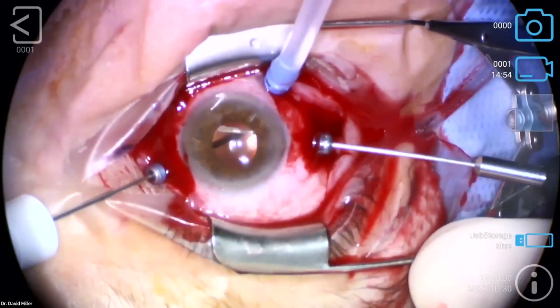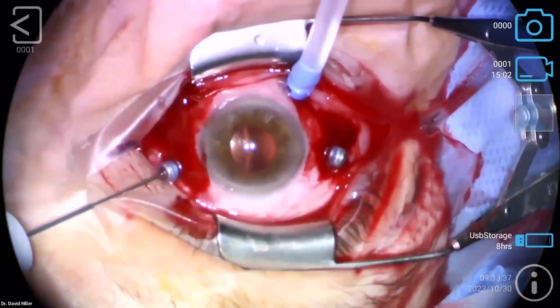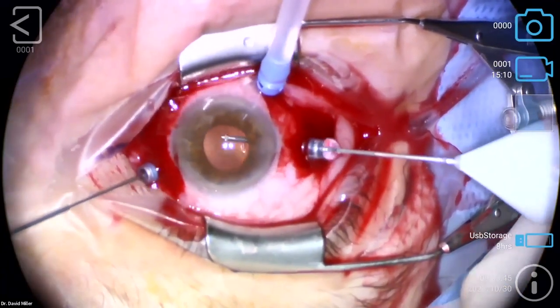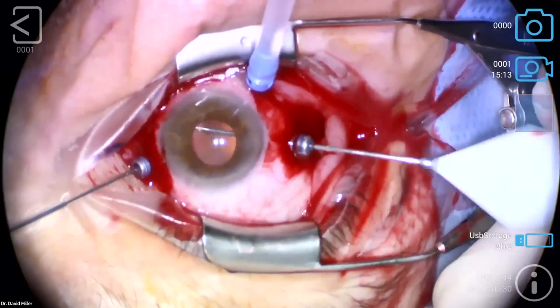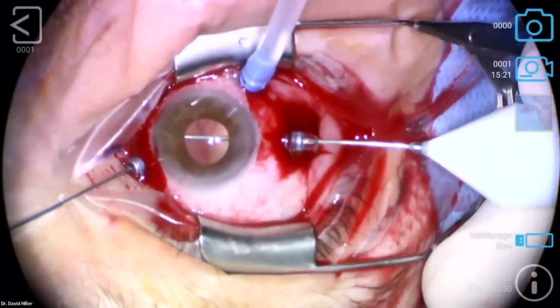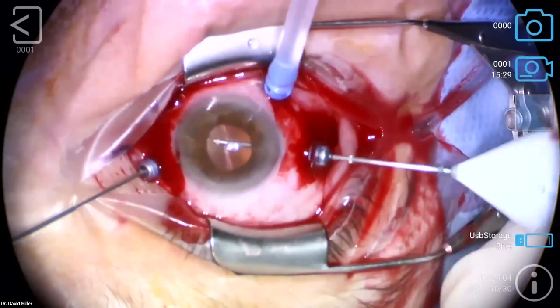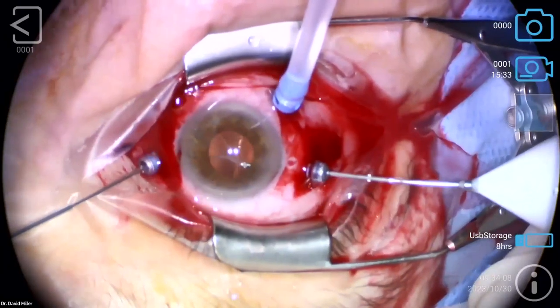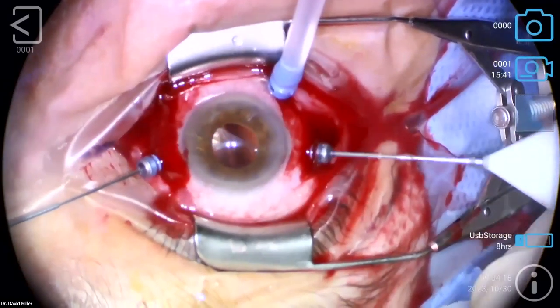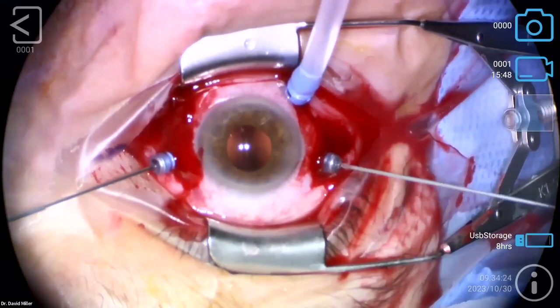If we can find it. I kind of lost sight of it. Can I have the retractor back? This would be a part of the case you could let go, but I generally prefer to have all the remnants out. And we're just working that around. You have the forcep again. Nice thing about the forcep is you can pull it right out through the sclerotomy site.